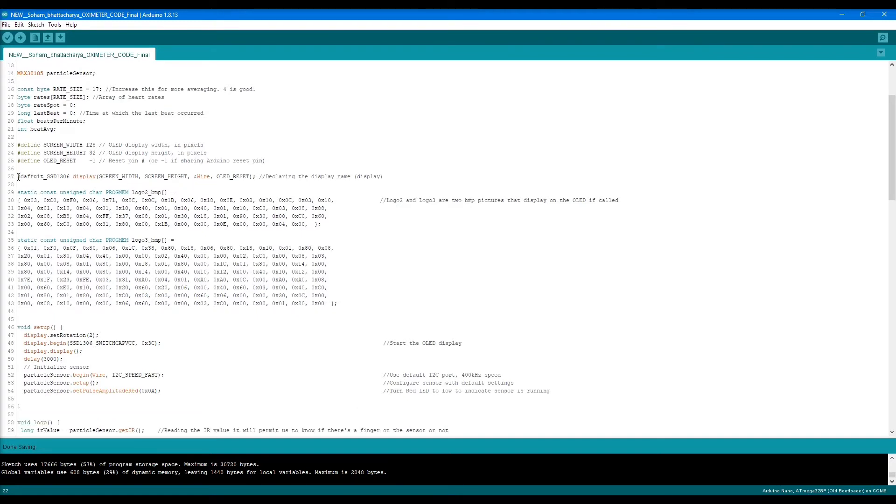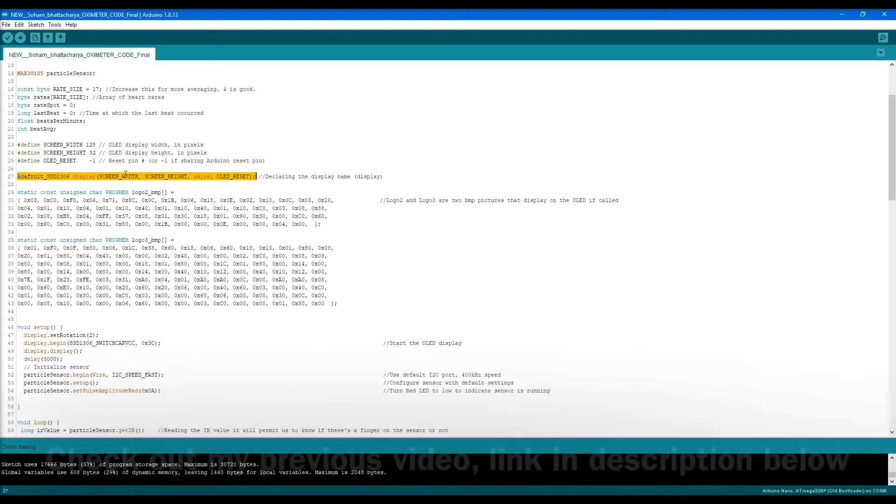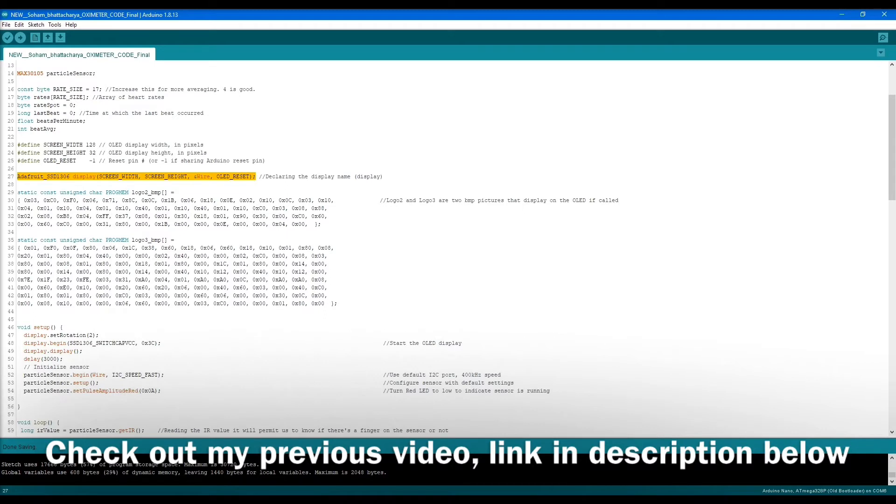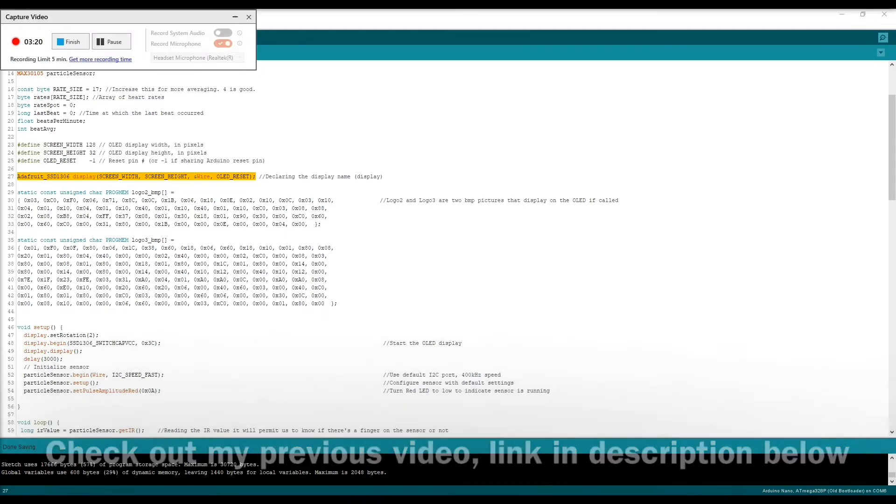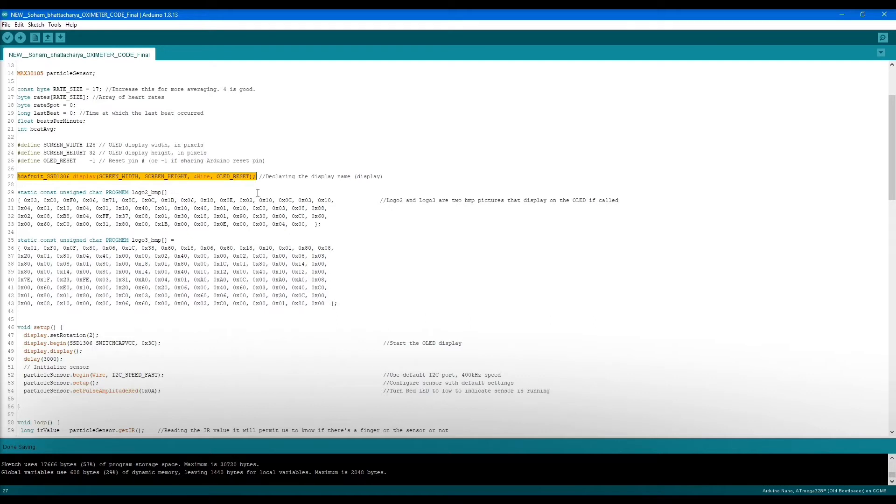In line 27, it declares the display name. This is where the SSD1306 OLED display gets initialized according to the screen width and height as defined here, and the reset also gets defined here. What happens here is that it displays the Adafruit library logo.